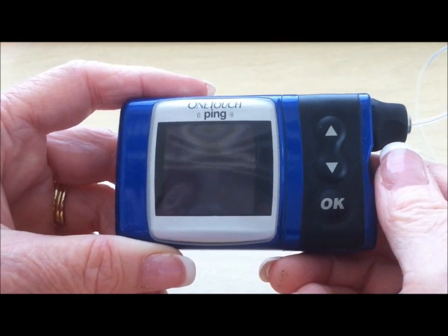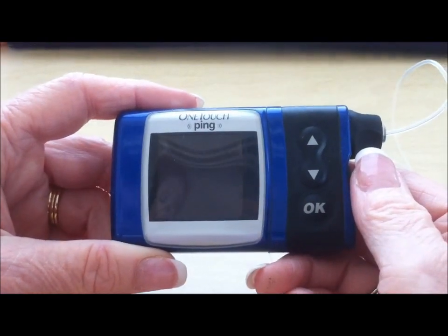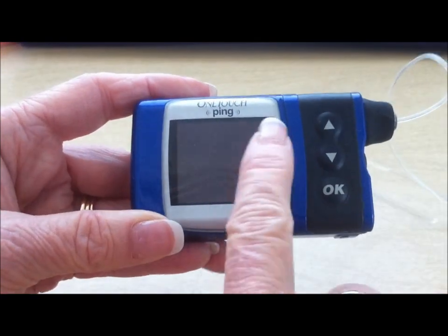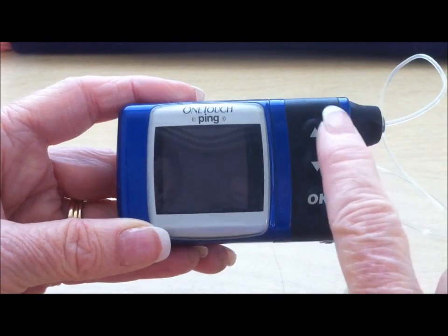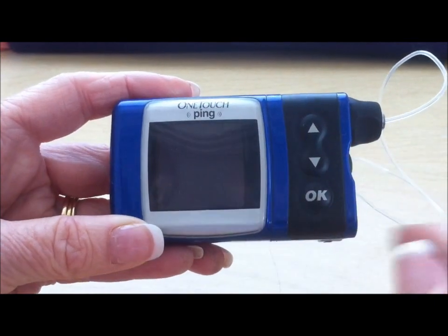This is a brief video description about how to use basic features on an Animus insulin pump, the one-touch ping. The main screen is dark. You have an up and down arrow that will either increase or decrease numbers or scroll through a series of menu options.